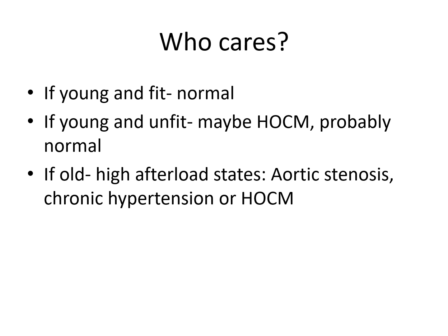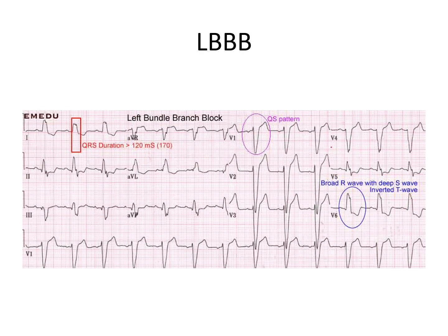Who cares about left ventricular hypertrophy? If you're young and fit, it's fairly normal to have this. If you're young and not particularly fit, then it's probably normal, but maybe you do have hypertrophic obstructive cardiomyopathy, although there are usually some other signs on the EKG of that as well. And if you're an older person, usually it's because of chronic high afterload states, chronic hypertension, aortic stenosis, or rarely hypertrophic obstructive cardiomyopathy.